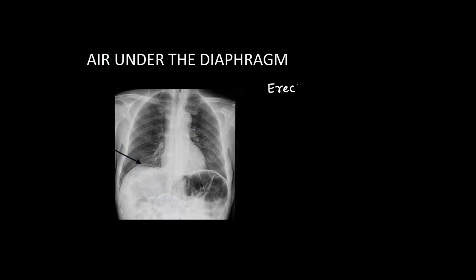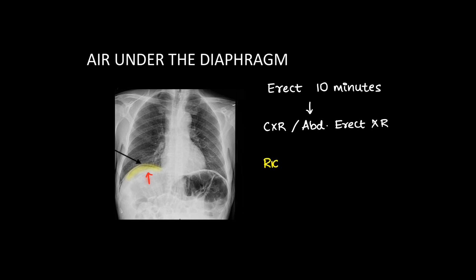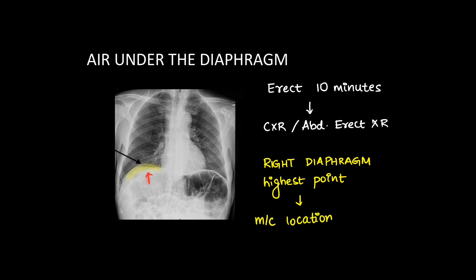The first and classic sign is air under the diaphragm. The patient has to be kept erect for up to 10 minutes so that the air rises up in the abdomen, and then a chest x-ray or abdomen erect x-ray can be taken. Here we can see air collected under the right hemidiaphragm, since it is the highest point in the abdomen. This is the most common location of free air and should not be missed even if only a chest x-ray is done.